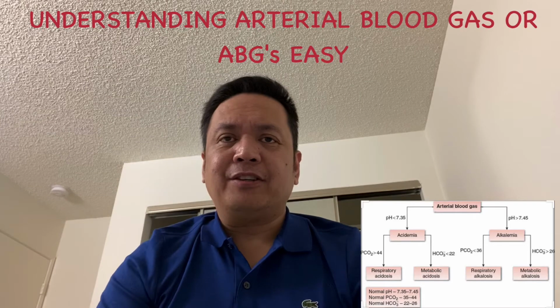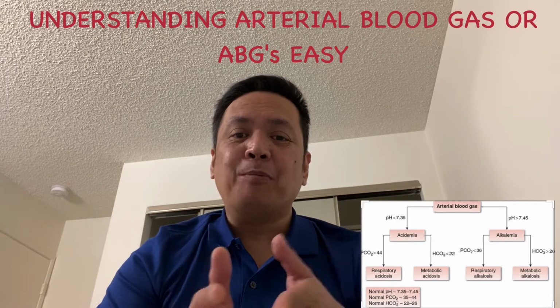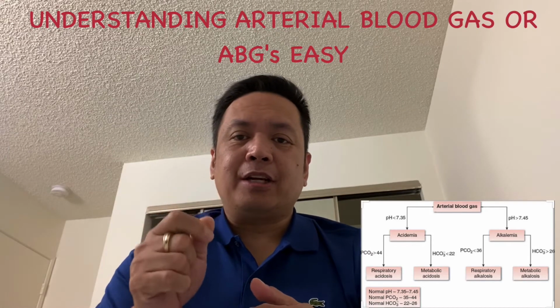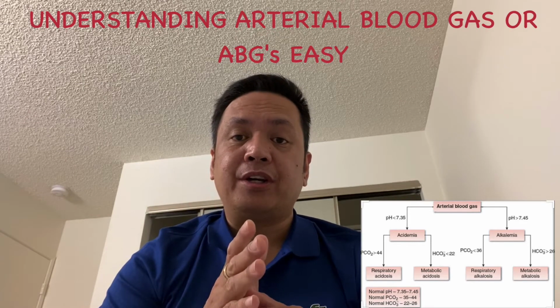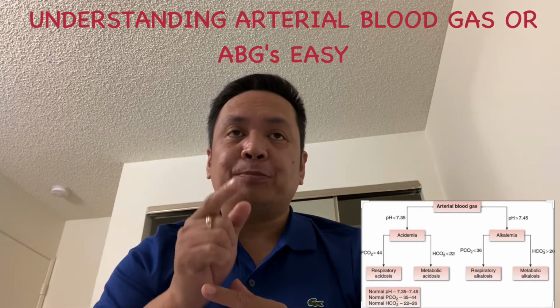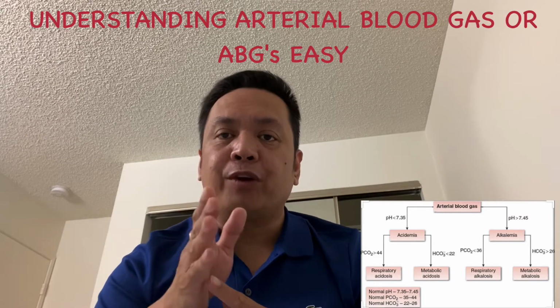So the first value that I'm going to discuss is the pH, which measures how many hydrogen ions are in the sample. This particular measurement determines if the blood is either acidotic or alkalotic. Normal values for pH range from 7.35 to 7.45.